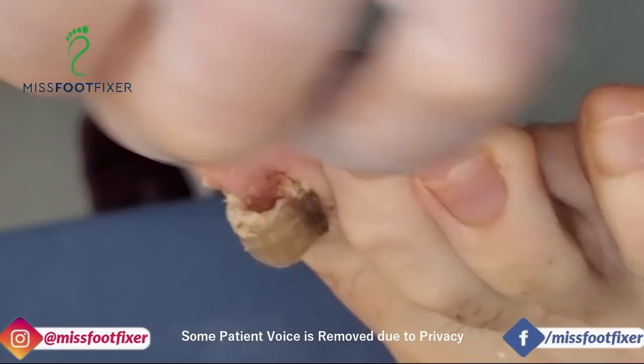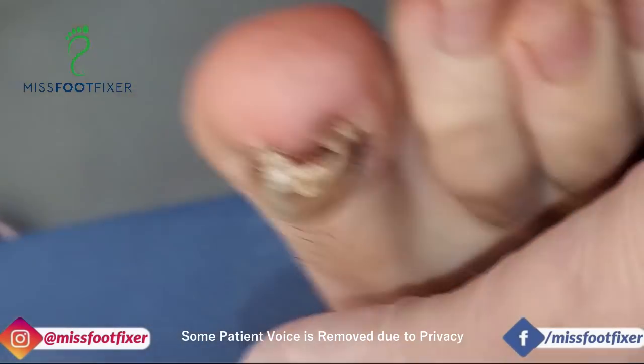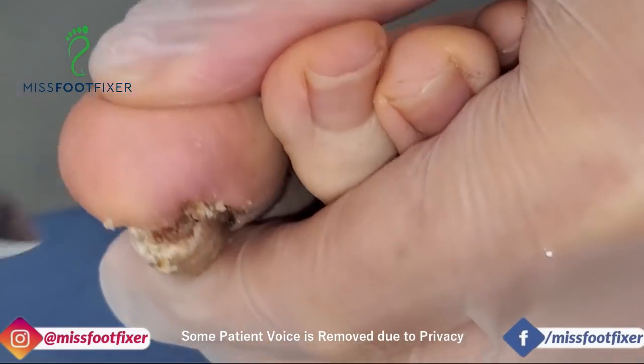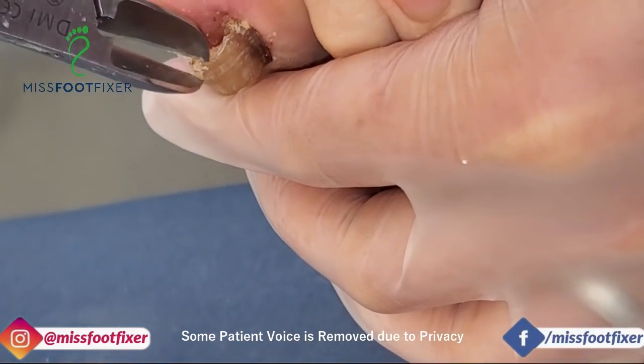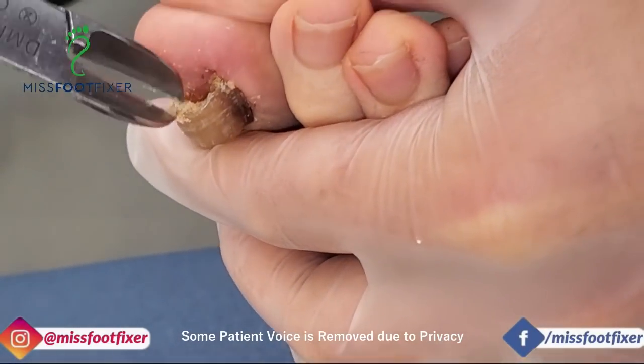It makes sense why it causes you pain and why so much stuff gets trapped in it and all that sort of stuff. This is just a massive raised cave. I don't know if you can see. Okay, I'm going to cut into this way and get it down to about here, okay? Because that's where the hole leads up to anyway.